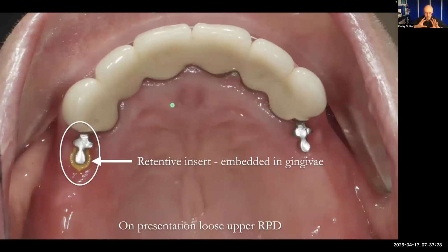Let's go back. All of these crowns are actually linked, so they're not split at all. So we've got a bridge, missing lateral incisor, and then 5 abutment teeth underneath this, which helps to support the precision attached retained upper denture. And what's really important is to link crowns. I think that's an important point if you're considering doing a precision attached denture.